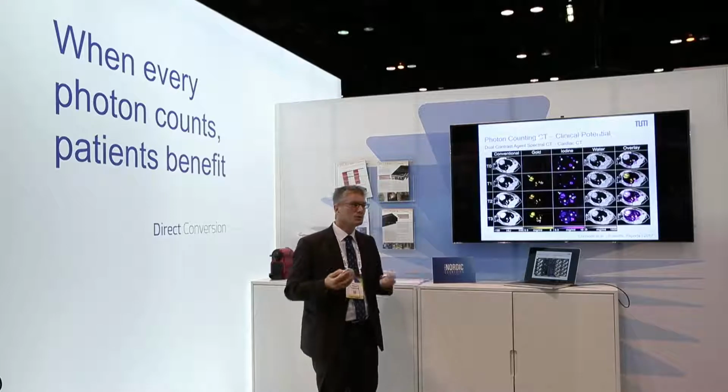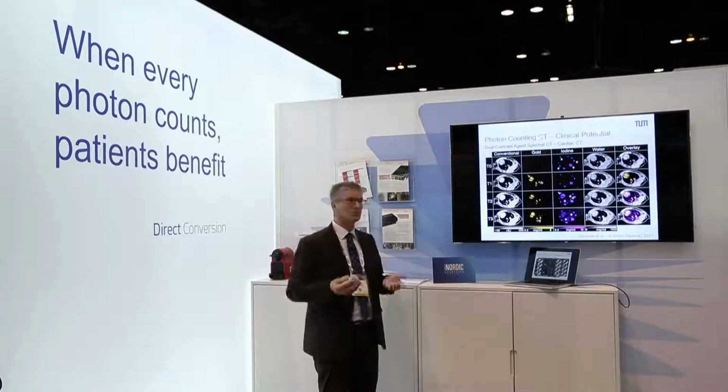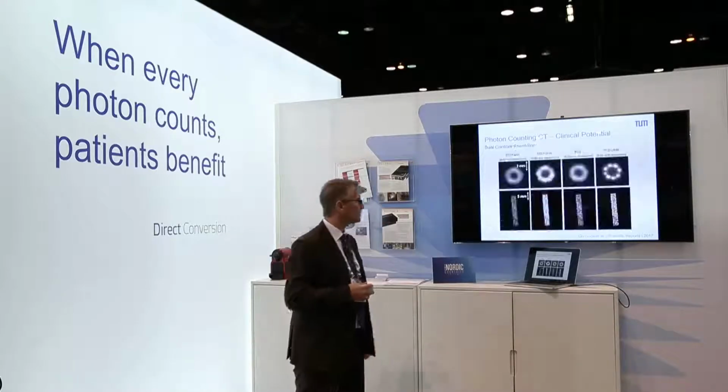Again, you could now use this information that is taken in one shot with a spectral scanner to look at the different pharmacokinetics of different contrast agents which are presently under development. So I think that's also a nice application.